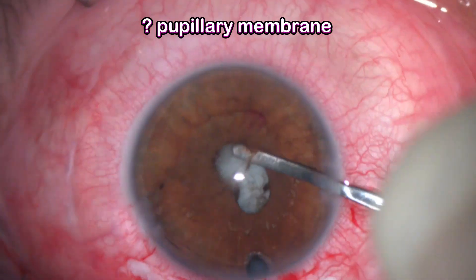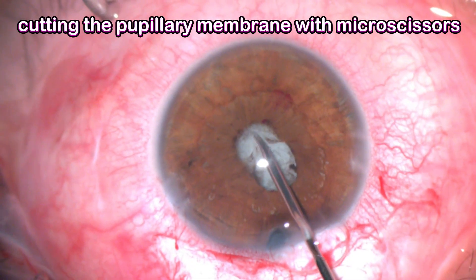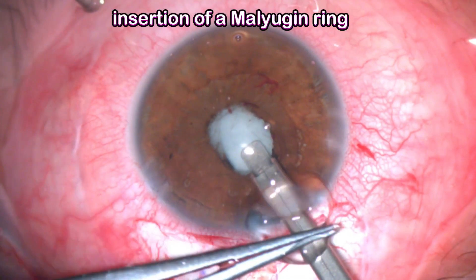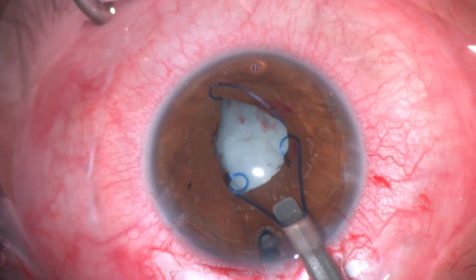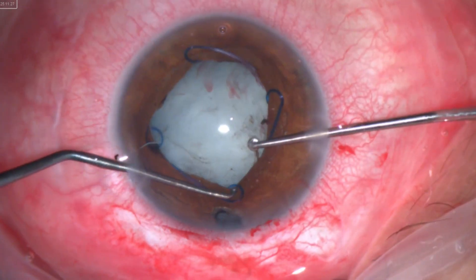I then noticed there was a pupillary membrane. I cut that membrane with micro scissors, and once the membrane was cut I injected viscoelastic — now we can see the anterior capsule. This was followed by placing a Malyugin ring to extend the small fibrotic pupil.